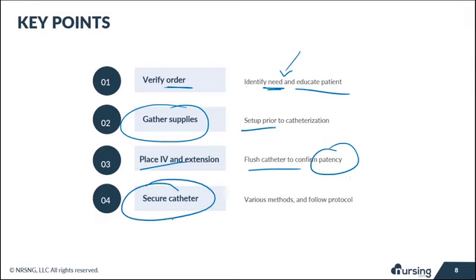Finally, you want to make sure that catheter is secure. You want to use whatever method is comfortable for you, including following whatever protocol or policy is in place.